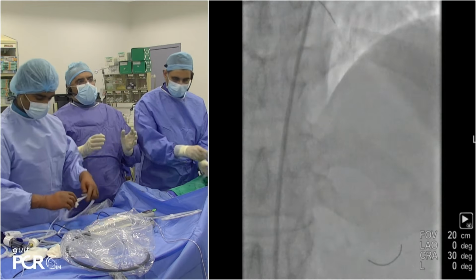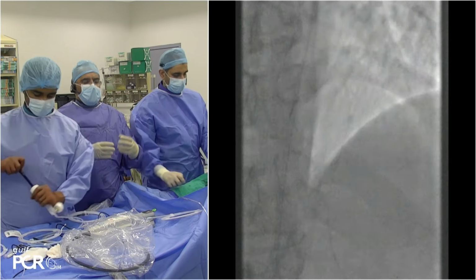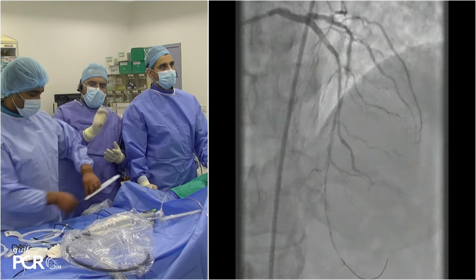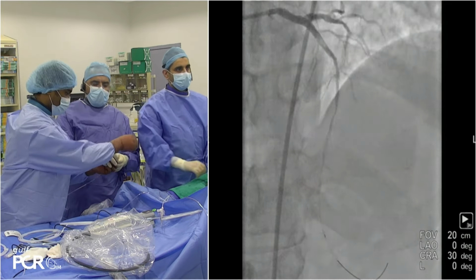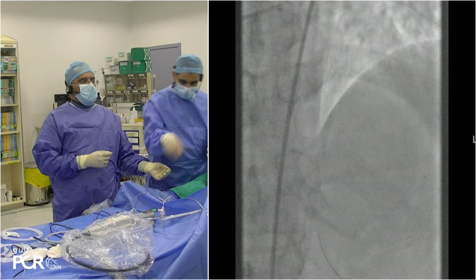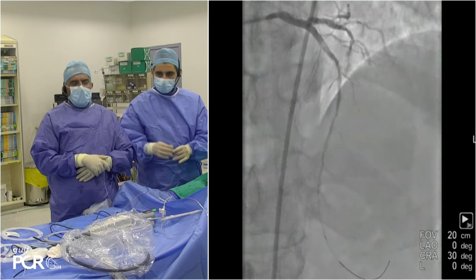We're planning. One thing is when you do the atherectomy, you have few things you look at or feel for. One of them is the tactile feeling, the sound of the machine itself. When it's hitting calcium, you hear a very loud sound, and when you shave it, it becomes less. And the other thing is we will look at it by imaging, which is the best way to look at your result. And this is what we're planning to do.